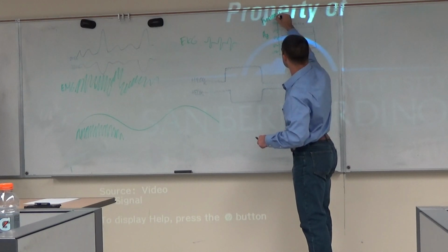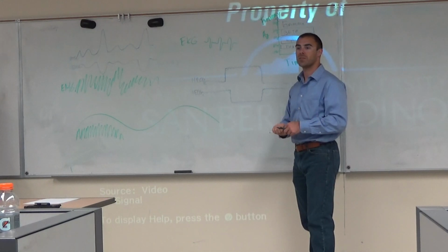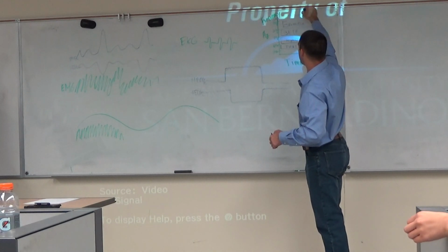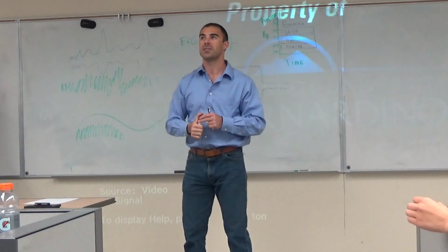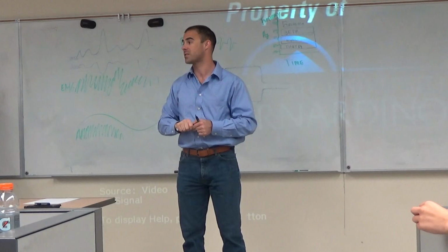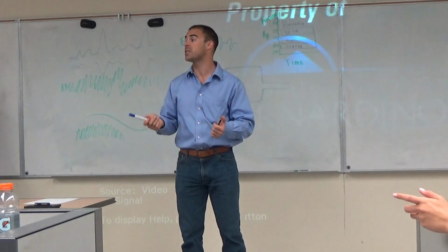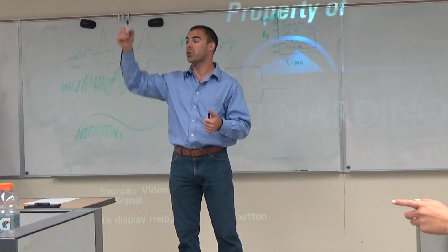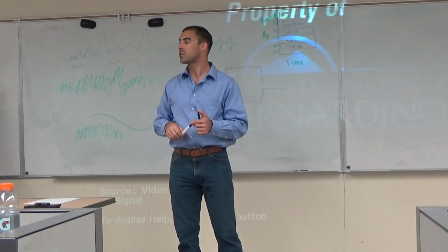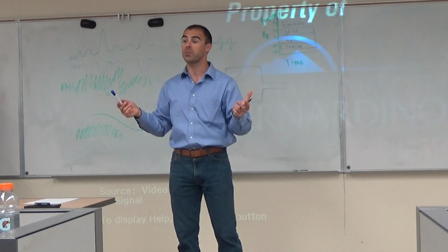And up at about 60 hertz, you're going to have a different type of artifact called line noise. Anybody know what line noise is? No electrical engineers in the house? So up here at 60, you're going to have a certain frequency of activity that's very high. That is basically the frequency of your lights in the room. When we record brain activity in humans, our brains never produce activity that's 60 hertz for the most part. That's very fast. And even if they did, we would not be able to measure it because when we record it, we also record electrical magnetic activity coming down from the lights. And they tend to oscillate at about 60 hertz. So that's the hertz of the line of electricity from the light. So that's one more artifact we can add to the mix.